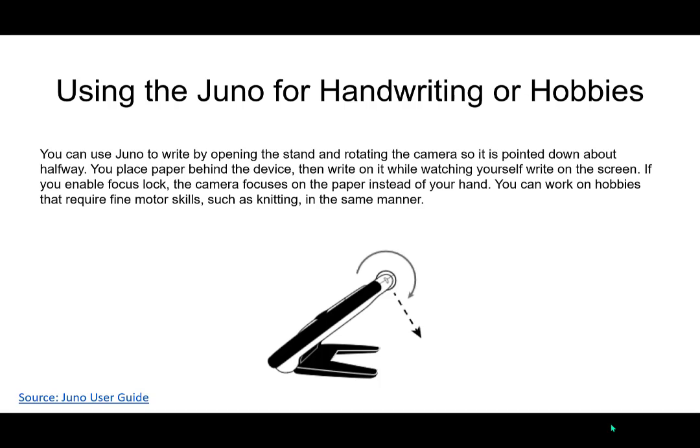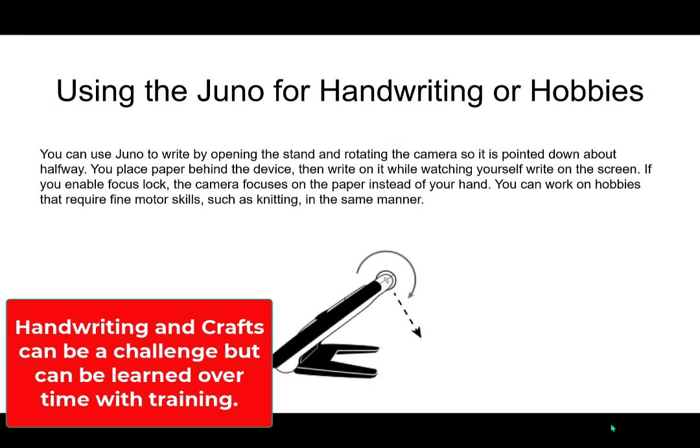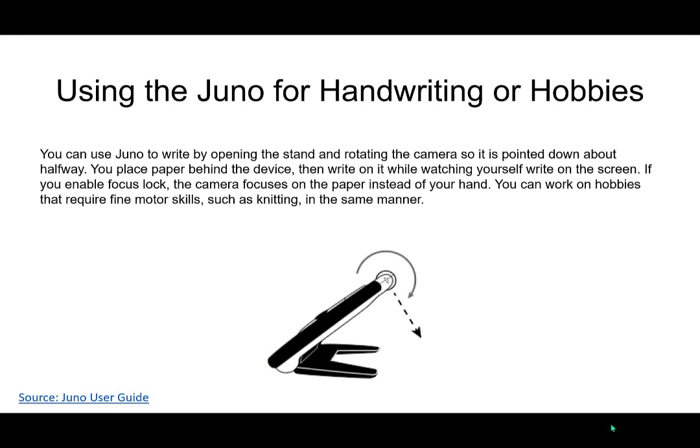The Juno can also be used for handwriting or hobbies. As an aside, I find handwriting and hobbies really a challenge to do under the Juno, and it takes a little bit more work. Some students are willing to put that work in because they really want to be able to do these things under the Juno. Other students are less likely to want to do that. So just be aware as we progress and move forward.